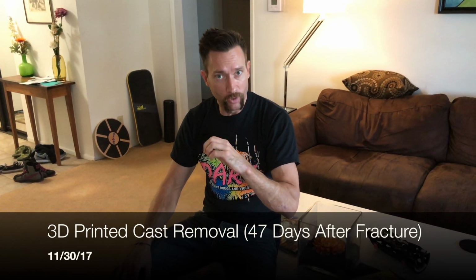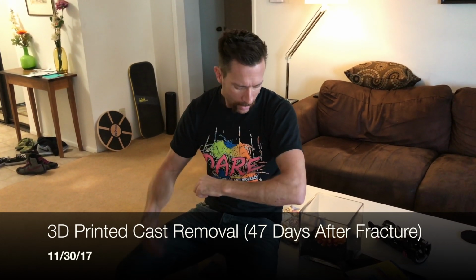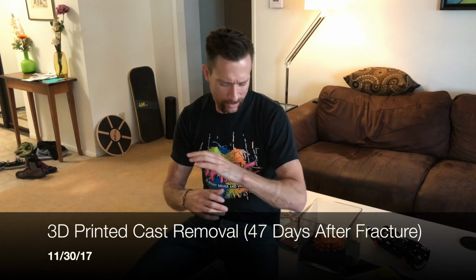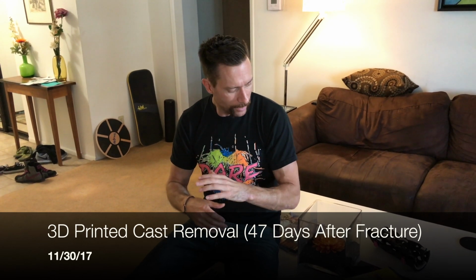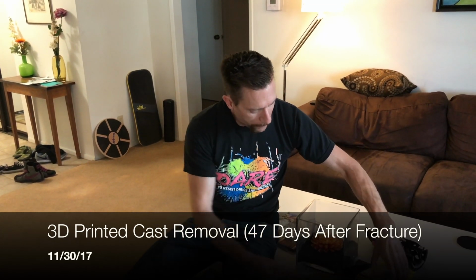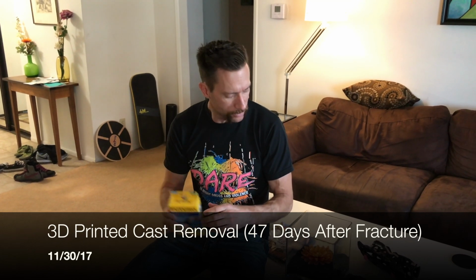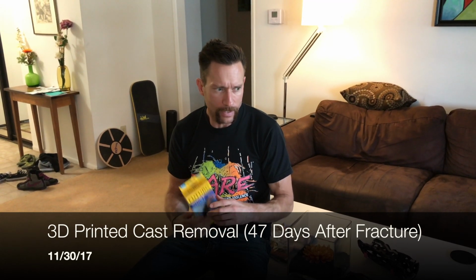Not to say that I'm going to be free moving over the course of the next 10 minutes, but it's going to take a few weeks. Obviously, I've got a lot of strength to gather back here through all of this. So one thing he said is when you're hanging around the house, just keep your arm out because it needs to start building that strength and flexibility back up. And I'll be doing exercises and looking into rehab. When I'm going to get back on the bike, I will use this, and if I'm at the gym, I'll be using a wrist brace with a metal piece in it that will help solidify it.